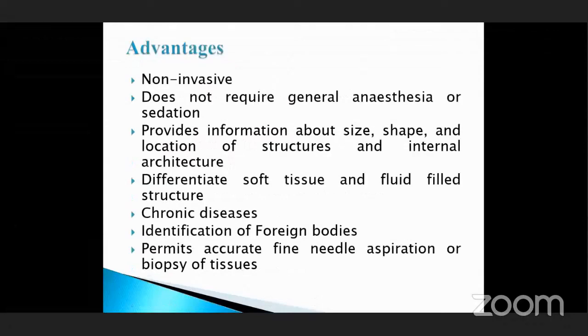Now, advantages of ultrasonography. It is a non-invasive technique, so it has no radiation exposure, and can be repeated many times without causing much discomfort to the patient. It does not require general anesthesia or sedation, and provides information about the size, shape, location of structure, and internal architecture of the organ.